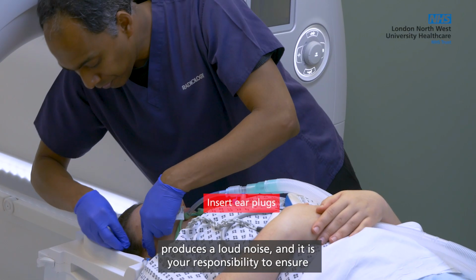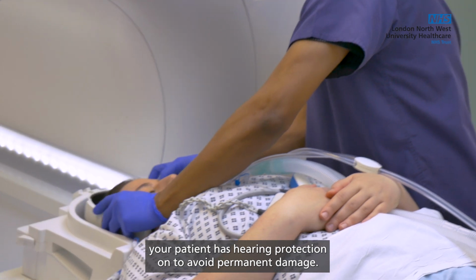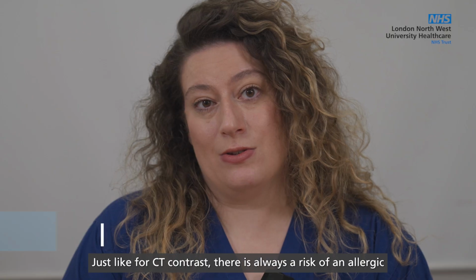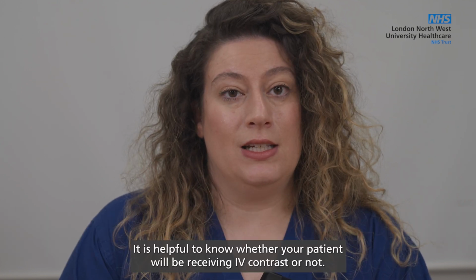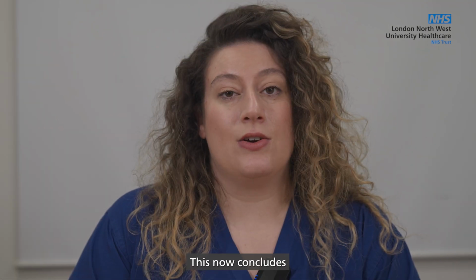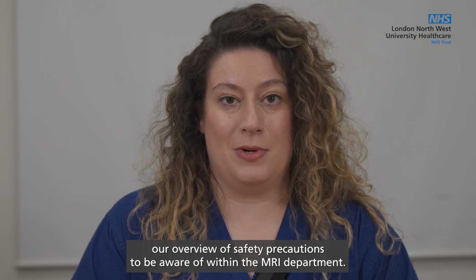The MRI scanner produces a loud noise, and it is your responsibility to ensure your patient has hearing protection on to avoid permanent damage. Just like for CT contrast, there is always a risk of an allergic reaction to contrast administered to your patient during their scan. It is helpful to know whether your patient will be receiving IV contrast or not. This now concludes our overview of safety precautions to be aware of within the MRI department.